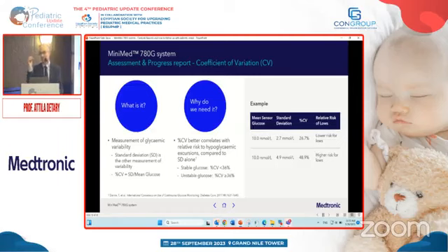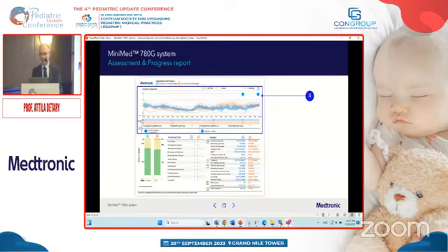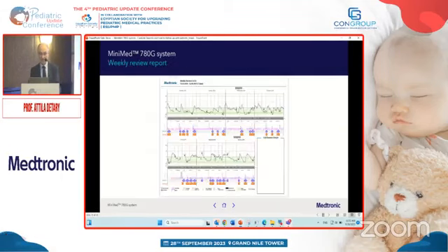And this coefficient of variation puts it in one figure. So it's the standard deviation divided by the average. And you see the guidance here, 36%. So if this coefficient of variation is below 36%, then the glucose variability is acceptable. If it is higher, you should think how to reduce it below 36. Okay, so I speed it up a little bit. So this is another report showing 7 days.